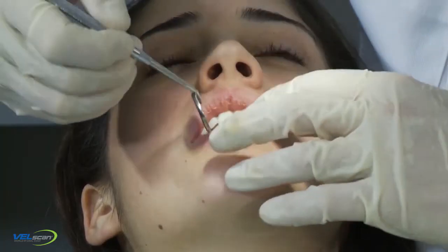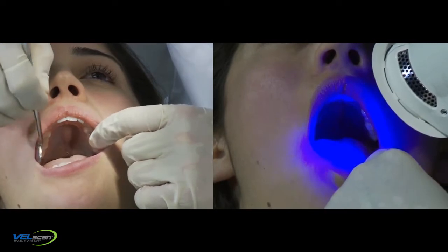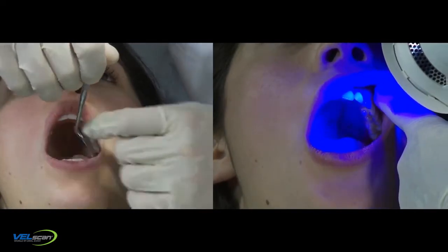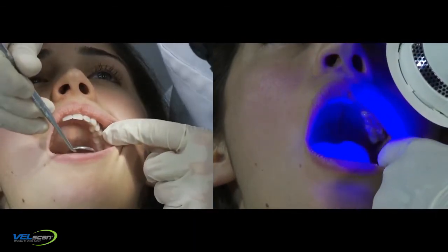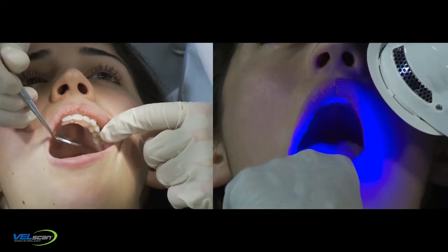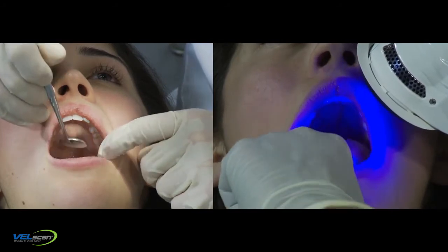If a suspicious area is discovered, re-evaluate under white light and VELscope VX, trying to identify what might have caused the region to appear abnormal. Take into consideration its appearance under both VELscope VX and white light, its response to palpation, as well as patient history information, including risk factors.